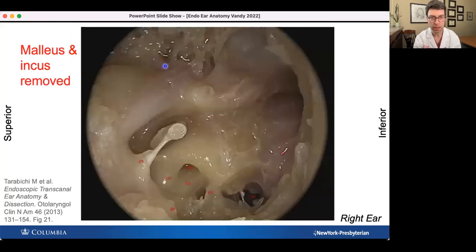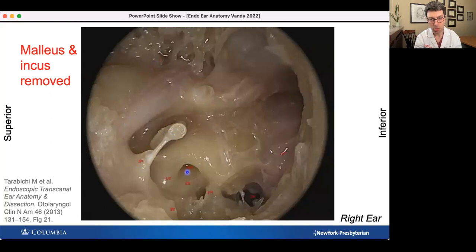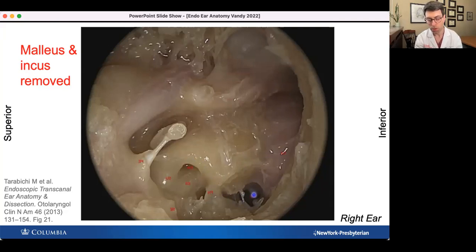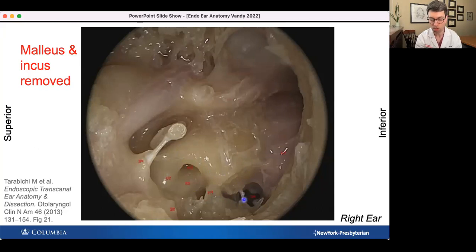Here's one more image with the incus and malleus removed. Our three parallel friends: number one, the horizontal canal; number two, the facial nerve; number three, the stapes — with the head of the stapes and stapedius visible. Here's the promontory with the round window niche. The overhang superiorly becomes the subiculum, and inferiorly becomes the funiculus. Here's the carotid artery at the eustachian tube orifice. This black hole is a hypotympanic air cell — if you're doing a cochlear implant and are confused, you might insert the electrode here instead of near the round window. You want to make sure you're right near and inferior to the stapes, not lost in the hypotympanum.